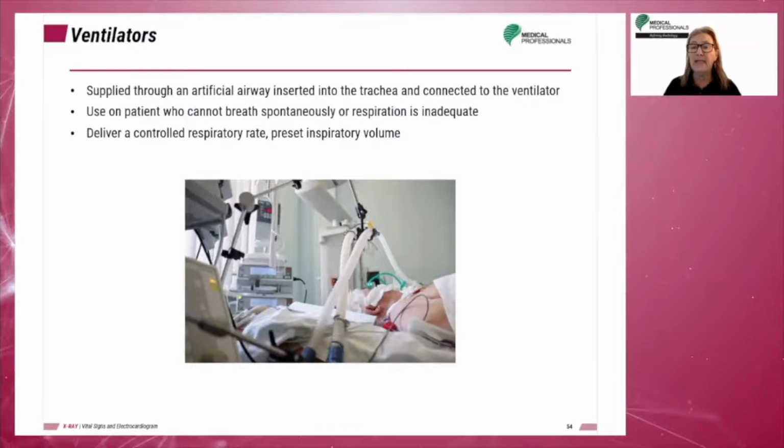Imaging can be needed to confirm placement of the endotracheal tubing for patients on a ventilator. When imaging, care must be taken to watch for disconnecting tubing. Any malfunction can be life-threatening. The system allows a slack in the tubing to prevent condensed water flowing to the patient's lungs and potentially drowning them.